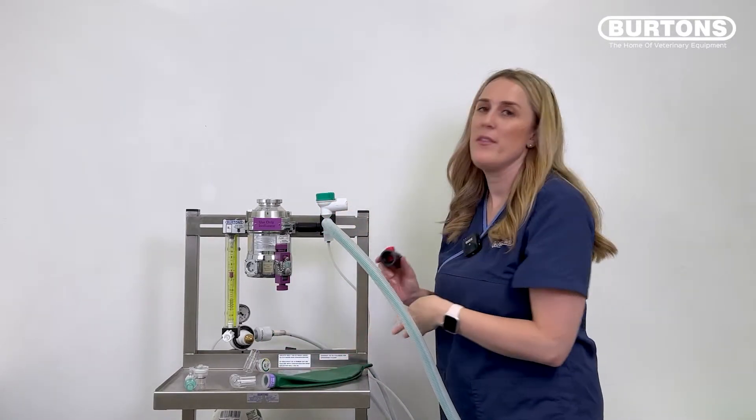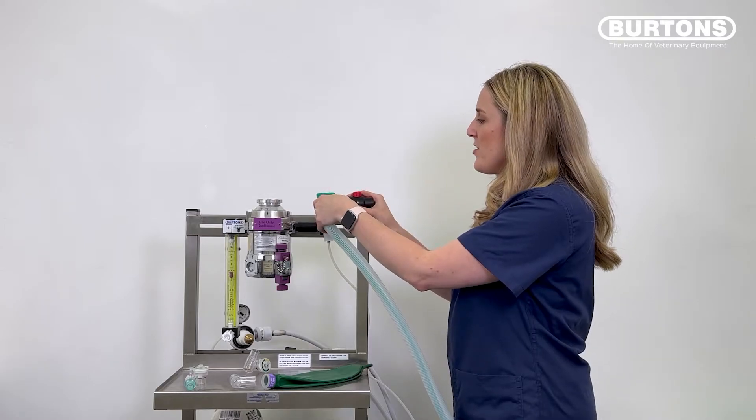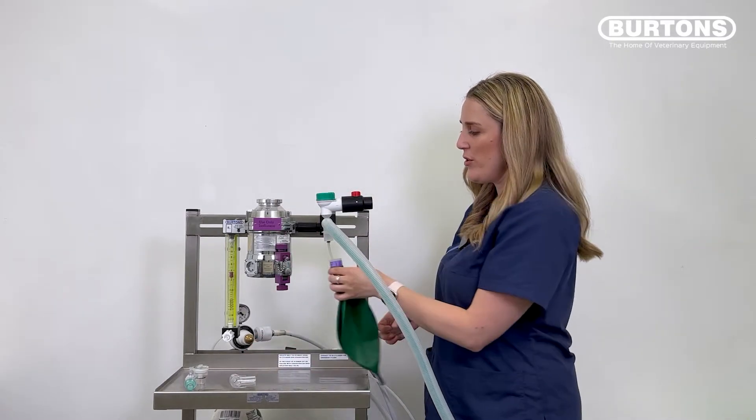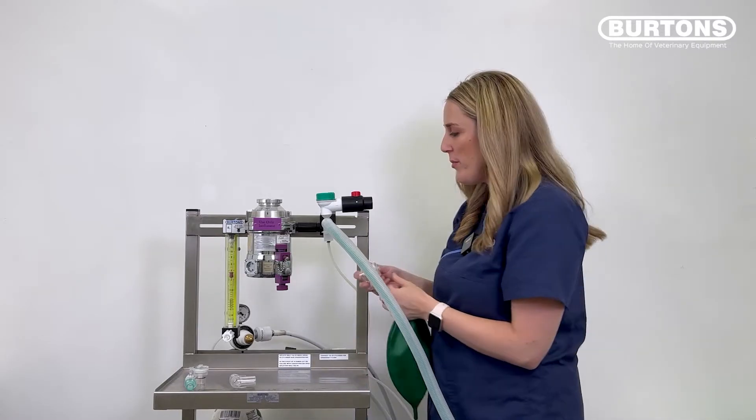Attach that to the common gas outlet. You can put our IPPV button valve just onto the scavenging system here. And where our reservoir bag would go is just here. So that's actually where I'm going to go and put in our manometer.